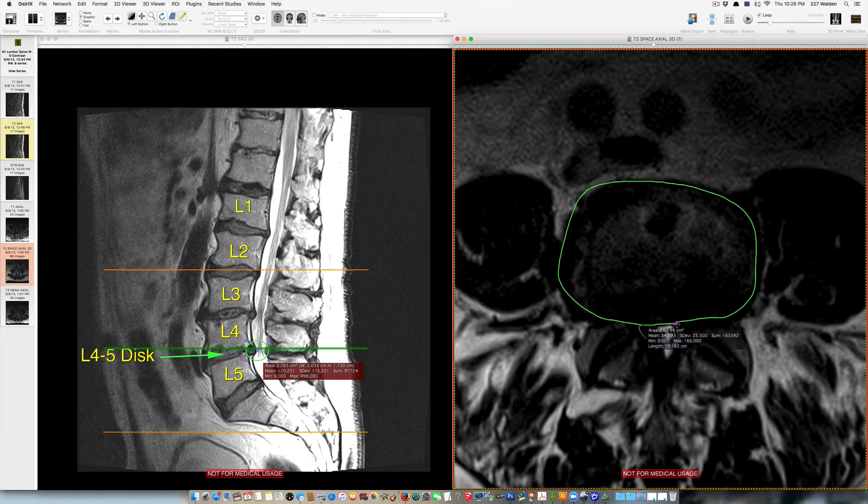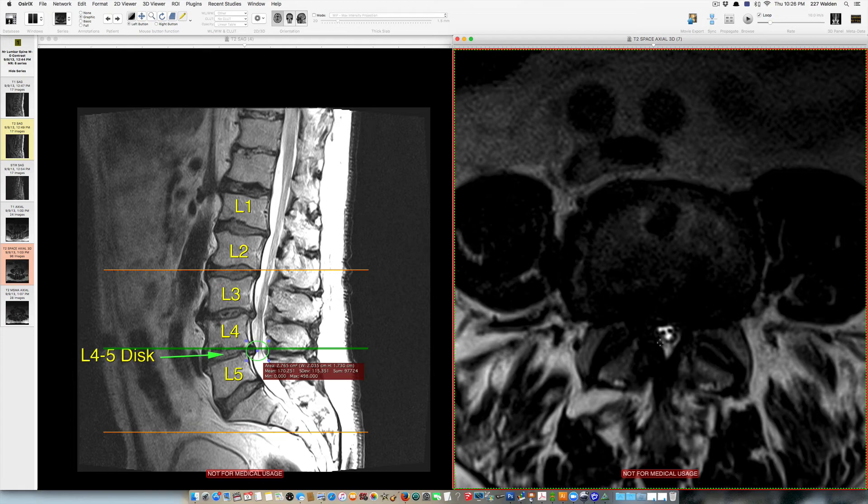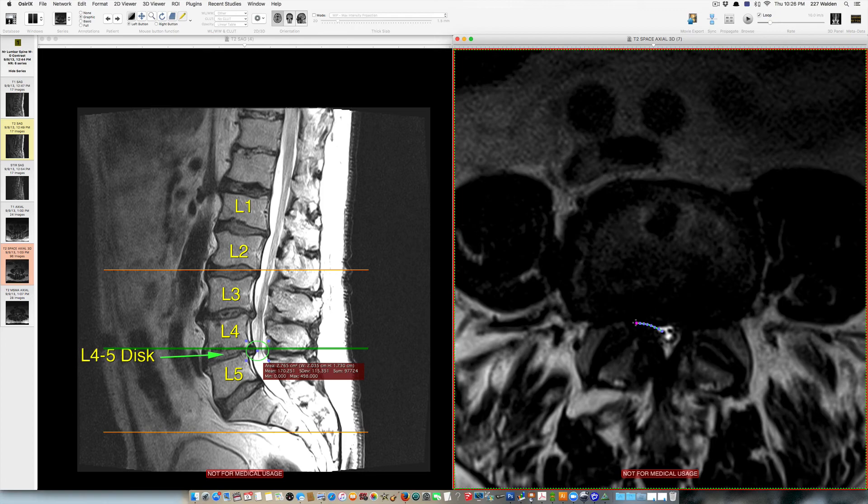So the most common area that people get compression of the nerve root is here in an area called the lateral recess, which is just in here, which is caused by a combination of facet enlargement and bulging of the disc. And the nerve root is trying to sneak out through a little passageway called the neural foramen right through here.